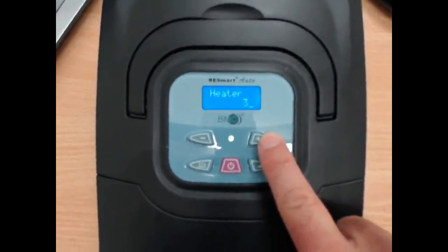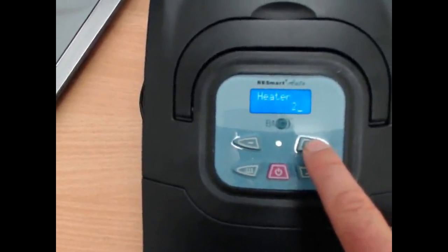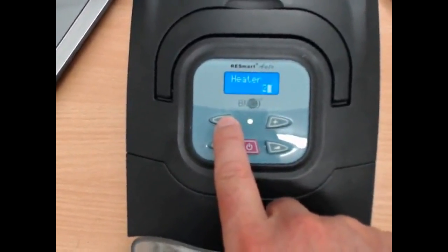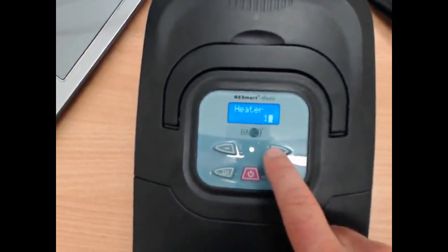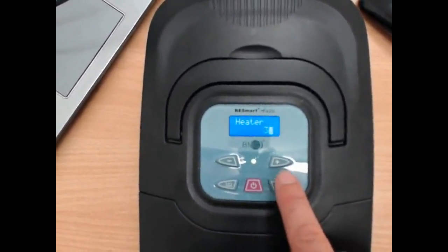Okay, so this one runs between 0, 1, 2, 3, 4, 5. Goes right up to 5. Okay, so when you select whatever you like, so if you don't like humidification, which is the amount of moisture in the air, you choose a nice low number like 0 or 1. If you like a lot of moisture in the air because you've got a dry throat, you might need a bit more. So say 2 or 3, or maybe 4 or 5.